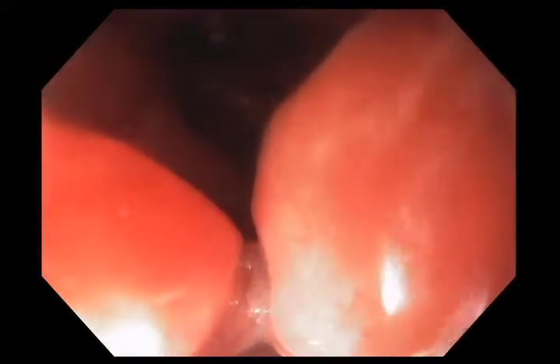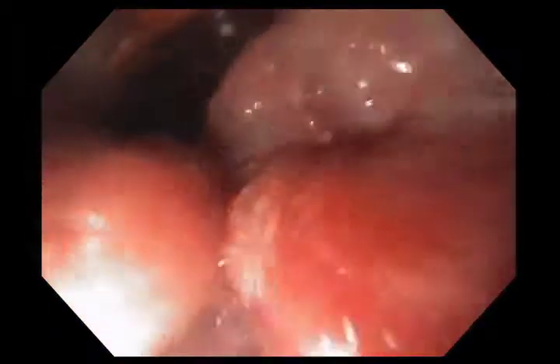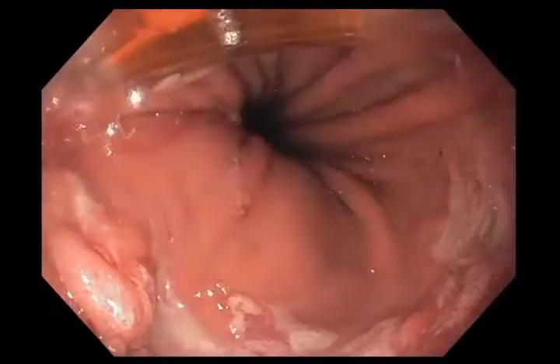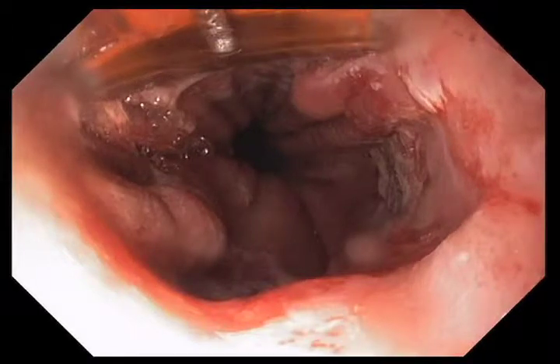We have completed this treatment. The patient is maintained on double doses of a PPI, and then typically I see them back at three months after this is all healed, and look at the esophagus to see if we've ablated all of the Barrett's.